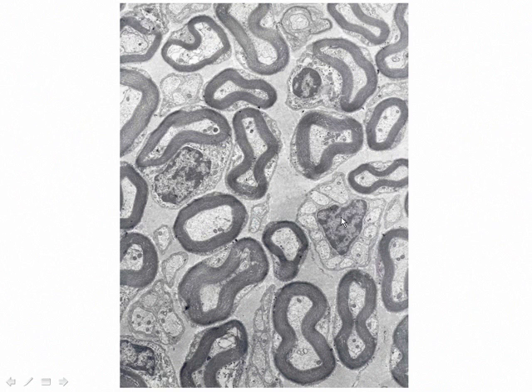Here is the nucleus of a Schwann cell, but you note that there is not myelin around the structures that it is wrapping. This is called an unmyelinated axon. And in fact, what is happening is that the Schwann cell is cradling 1, 2, 3, 4, 5, 6, 7, 8, 9, 10, 11, approximately 11 or 12 unmyelinated axons in little troughs in its plasma membrane as a way of protecting them.